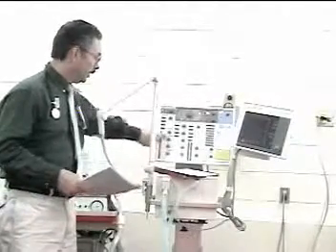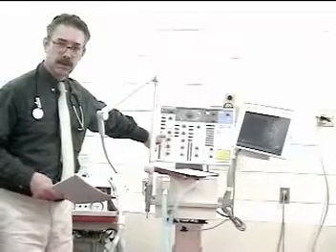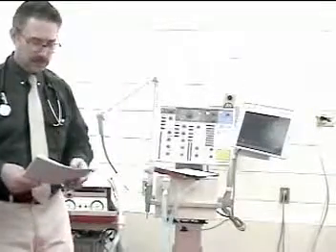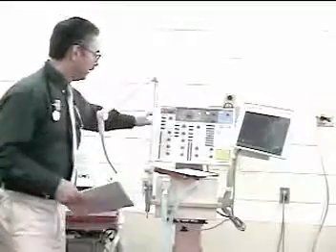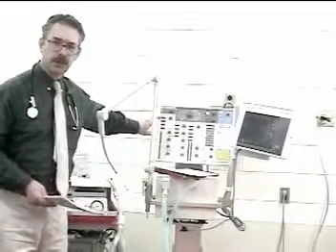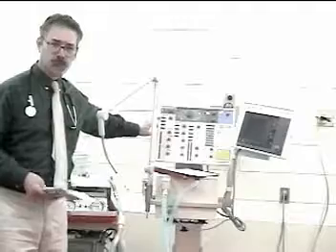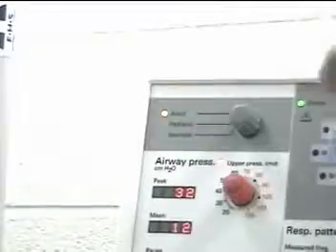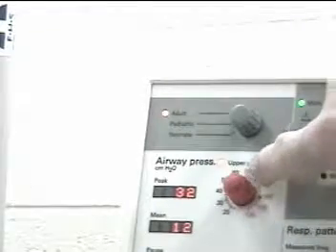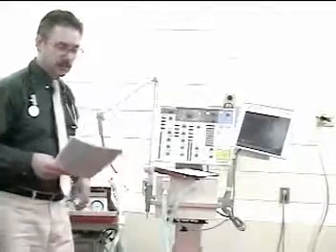Check whether pressure support is ordered. In this case, there is a lit indicator light showing pressure support is functioning — it was ordered at 10, and the dial is at 10. Peak pressure will vary depending on the delivered volume, the patient's airway resistance, and chest and lung compliance. Here the pressure is 32, and we set the high pressure limit knob to 42. This number may change between checks; just ensure it's not excessively high.